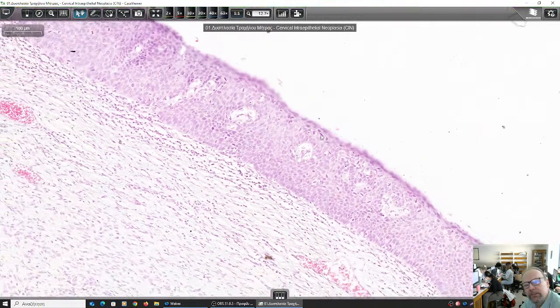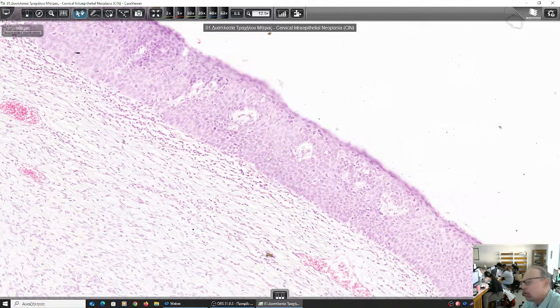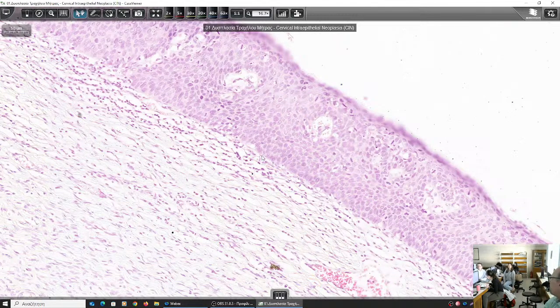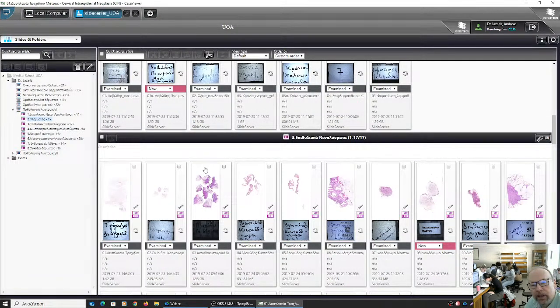All right. So this is dysplasia and high-grade dysplasia because the whole thickness of the epithelium has been replaced. Metaplasia is physiologic? Yes, it's almost physiologic because the new epithelium is mature. But this one, in addition to being metaplastic, is also dysplastic because it has loss of polarity, loss of maturation. However, it is not cancer. Why isn't it cancer? Because there is no invasion. You see that the basement membrane remains intact. So that was dysplasia. Let's have a look here.